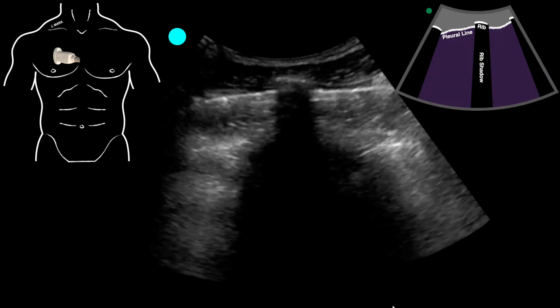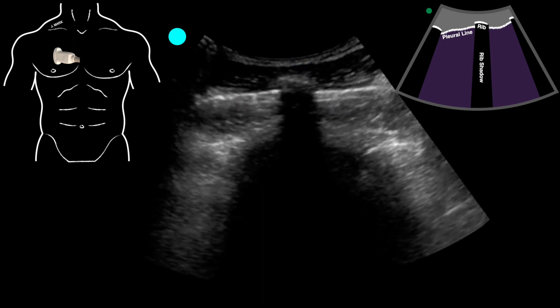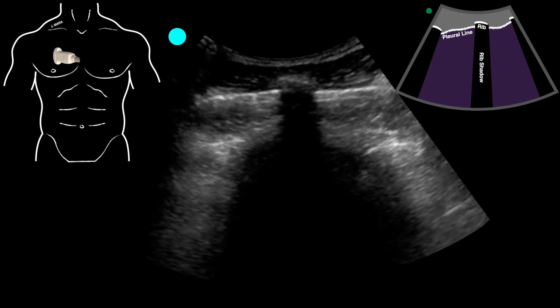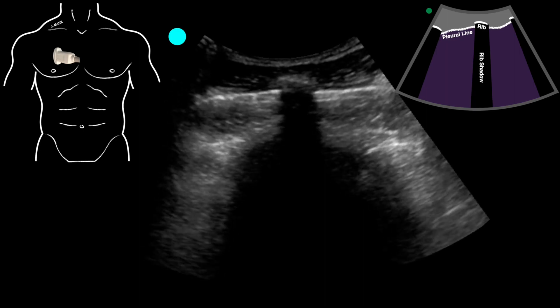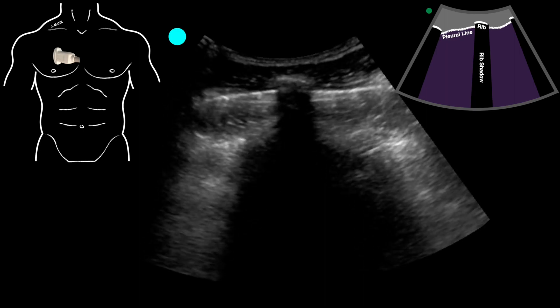As we continue this evaluation, we look at the patient's right chest to evaluate for a pneumothorax, since this patient has difficulty breathing. What we can see here is the pleural line, a rib, and then the next pleural space. As we look for that bright white line to slide back and forth, that indicates to us that there is no pneumothorax, because this is normal lung sliding here.